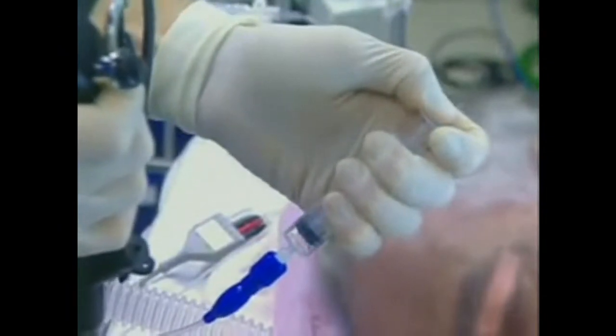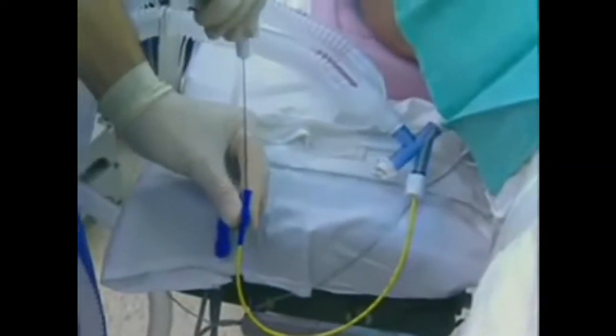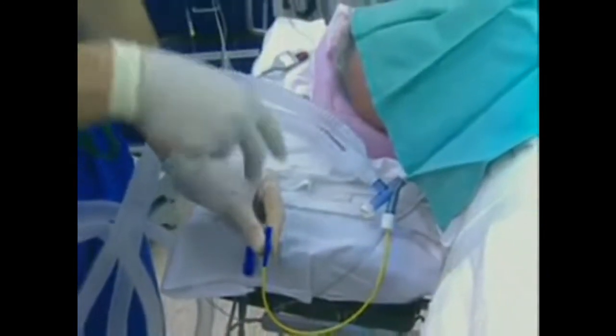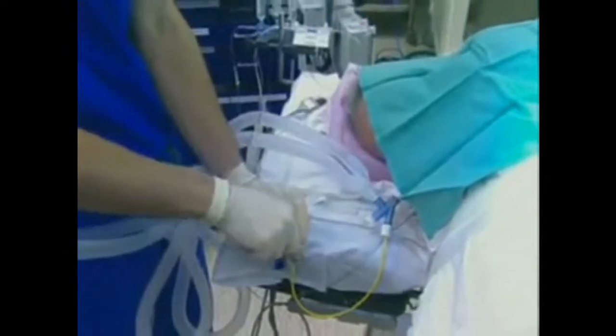It is important to deflate the balloon prior to final positioning of the patient, because some movement of the endotracheal tube or carina can occur. Once the position is confirmed, the guide loop can be withdrawn from the central lumen of the blocker, and the lung deflation can begin. The guide loop assembly cannot be replaced within the endobronchial blocker once it has been removed.